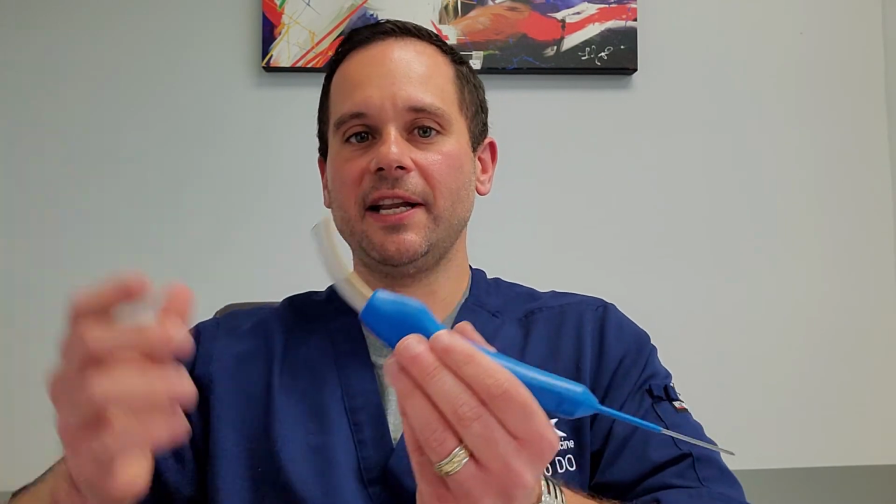Now, with advancements in ultrasound and new technologies, we have devices like the Tenjet. So using ultrasound, what we do is we find the tendon, we make a really small incision, about 3 to 5 millimeters, and then we insert this needle to the area of the bad tendon using the ultrasound guidance. What you can see is at the end of this needle, there's a little opening there, and what goes through there is high pressured water, and what that water does is it breaks up the bad tendon tissue and actually sucks it out. These two areas are connected to a machine that helps in that.